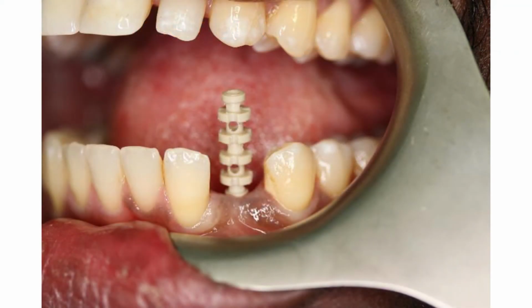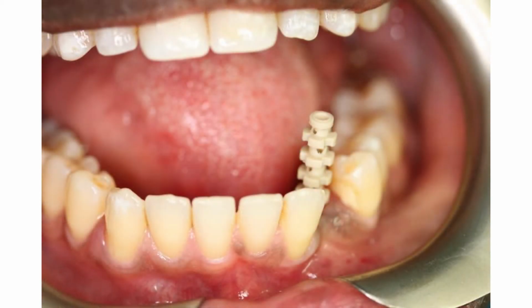So it's been pushed into the top of the implant. You'll notice that the top of this transfer is quite thin, and that's to enable you to push it through the gingiva without too much trouble. It also makes a nice seal and hopefully prevents any impression material finding its way under the gum.